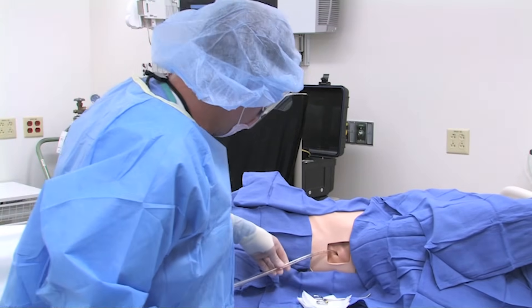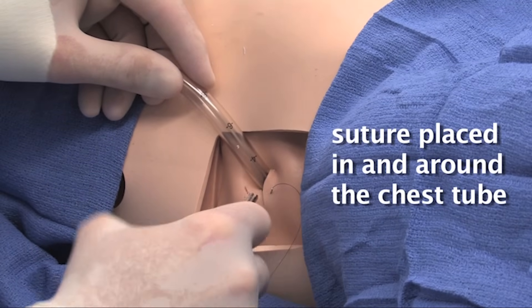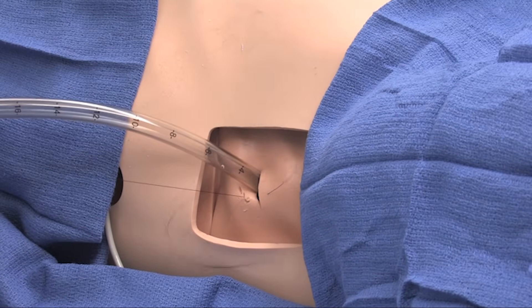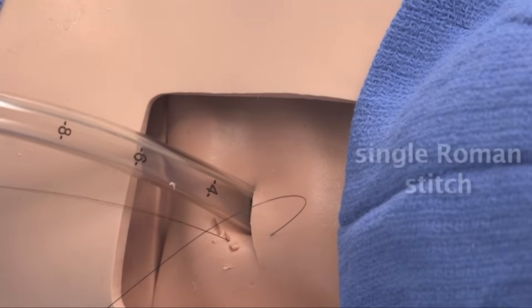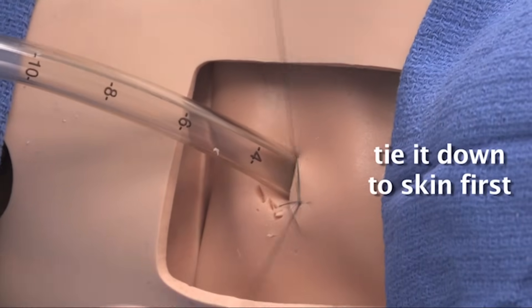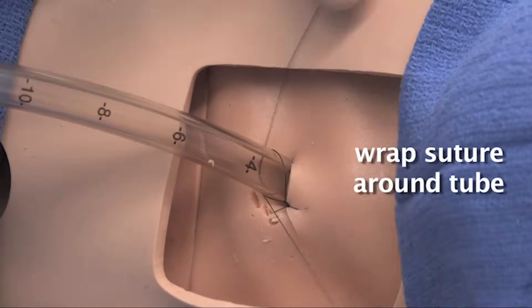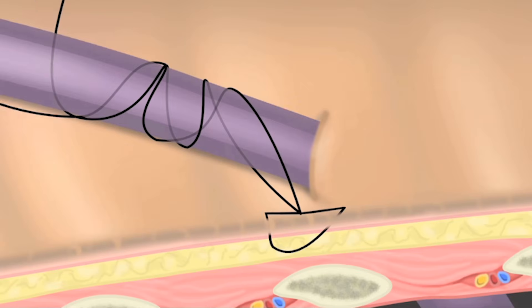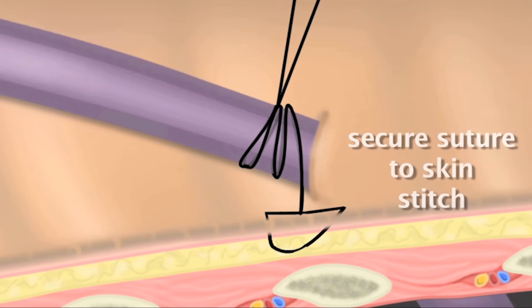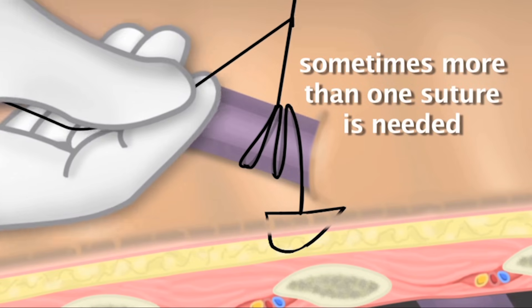Once the chest tube has been adequately placed, it needs to be secured in proper position with a suture in and around the chest tube itself. The chest tube may be secured in many ways. We perform a single Roman stitch, whereby we tie it down to the skin first, locking it in place, and then having the suture go in and around the tube itself to secure it to the skin stitch. Sometimes more than one suture is needed.